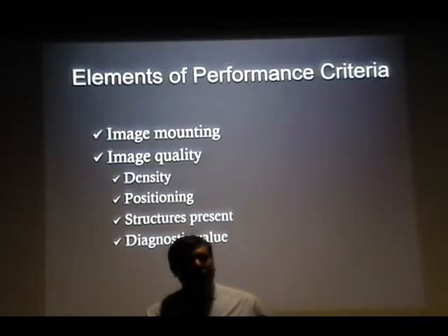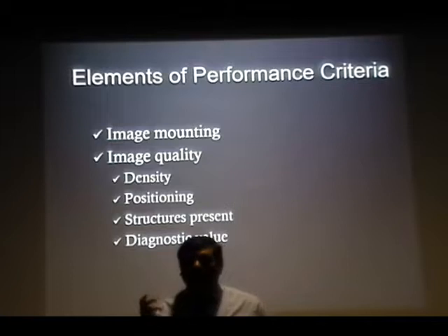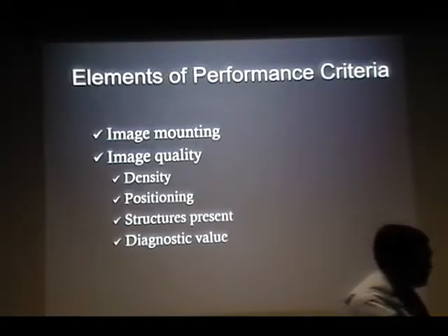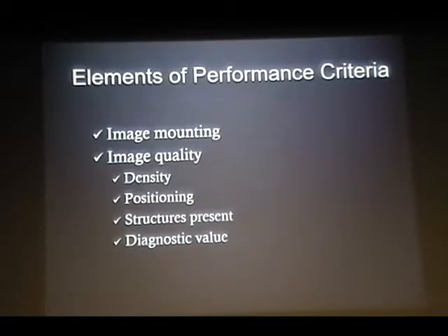By this time you should know how to mount a full mouth series. That's the basic step, right? Otherwise, if you send the same set of radiographs to a different dentist, or maybe to your junior, what if they drill class 2 on that, right? So mounting is critical, and there may be a couple of questions on mounting in your midterm exam.